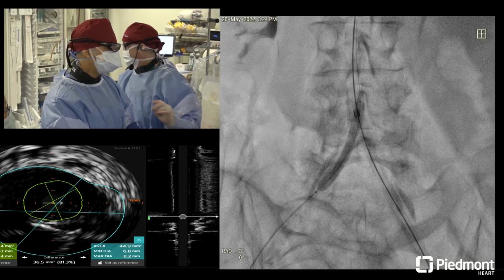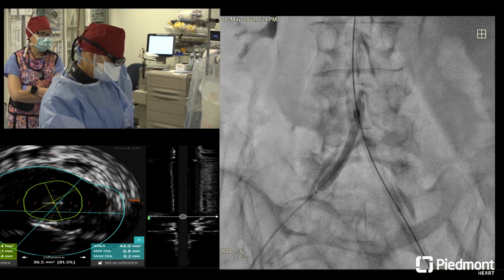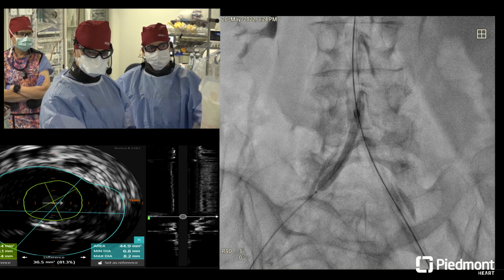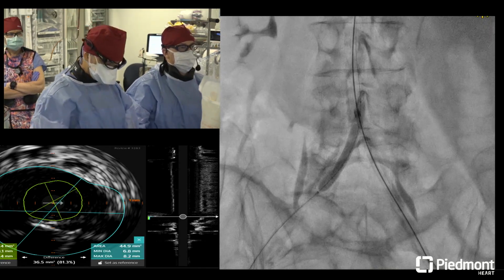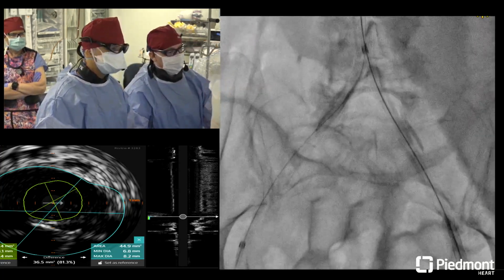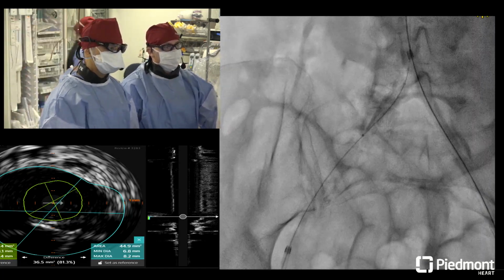That's another Kennyism. Kenny, what covered stents are you using right now? The VBX or the ICAST, they're both good, I think. I think me and you are the only people using ICAST anymore. I actually use ICAST. Okay, we got 3. I still use them also. I think the advantage of using an ICAST here is that they are 6 French compatible, so you can get away with that. Most are.